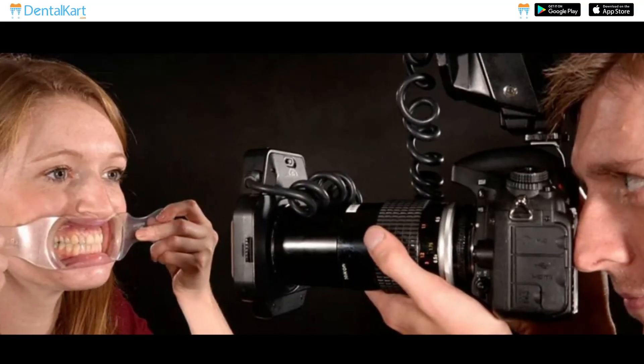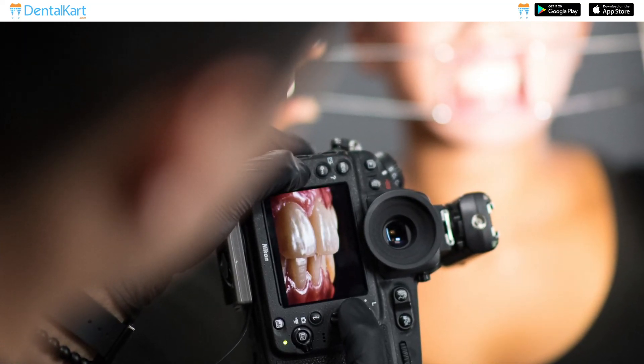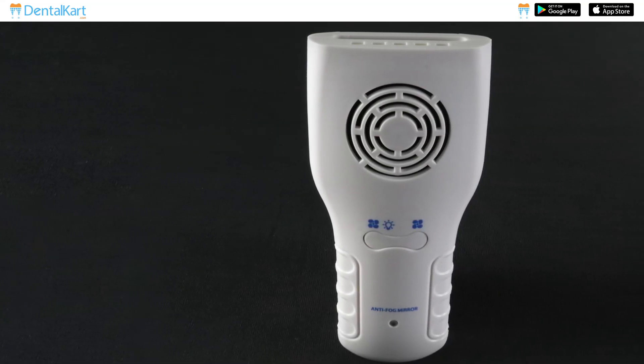Are you looking to improve the quality of your dental photography? Do you want to capture the perfect shot every time? Then you need the UU Ortho Dental Photography Mirror Kit.